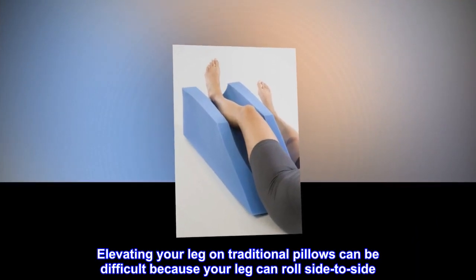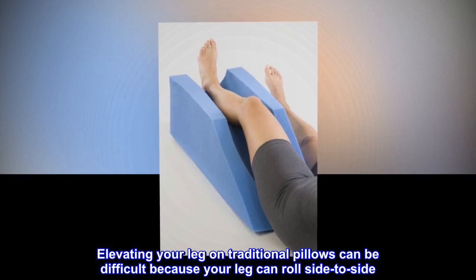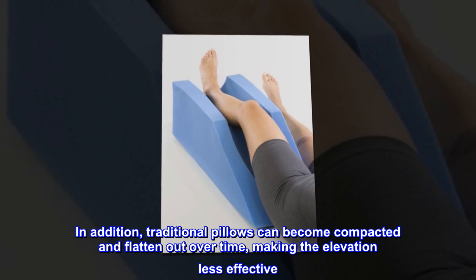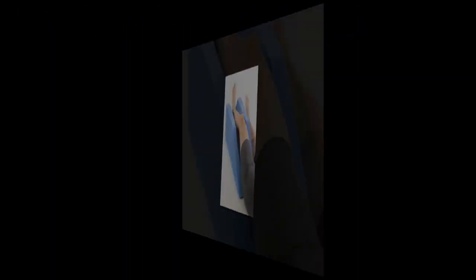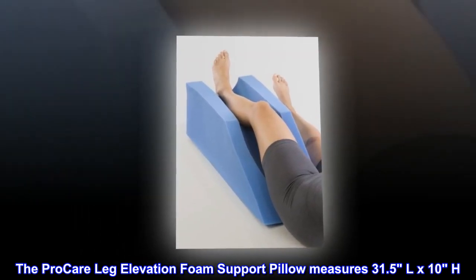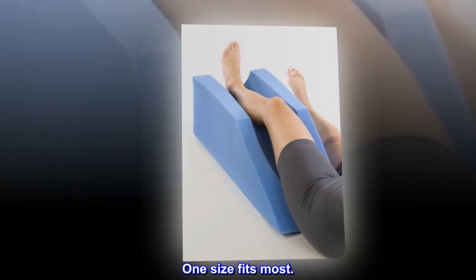Elevating your leg on traditional pillows can be difficult because your leg can roll side to side. In addition, traditional pillows can become compacted and flatten out over time, making the elevation less effective. The ProCare Leg Elevation Foam Support Pillow measures 31.5 inches long by 10 inches high. One size fits most.